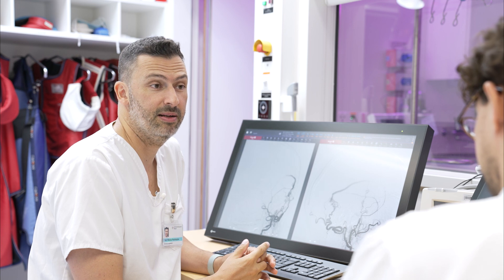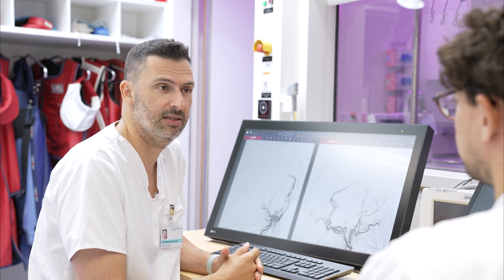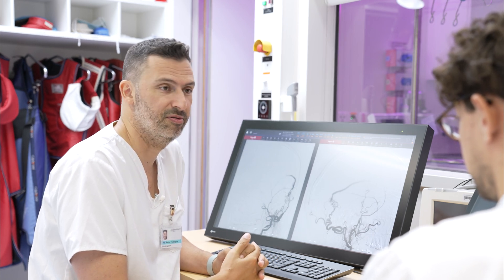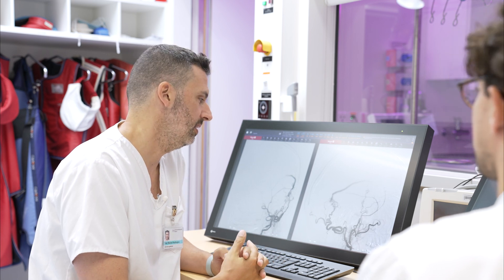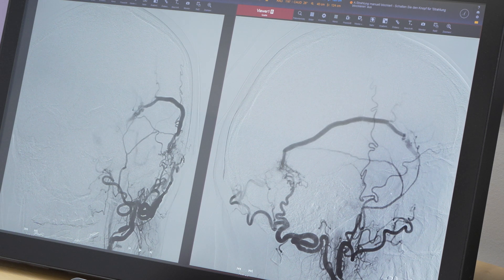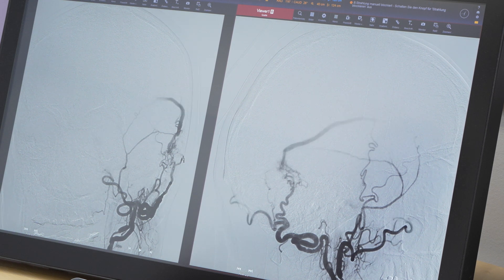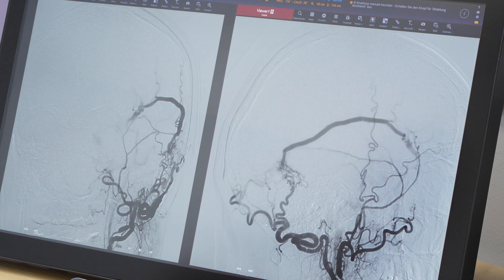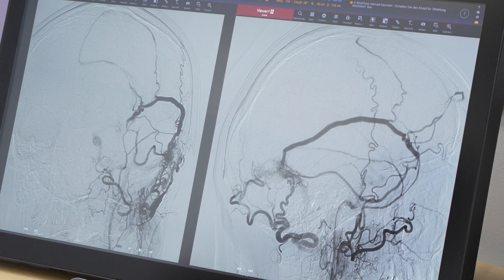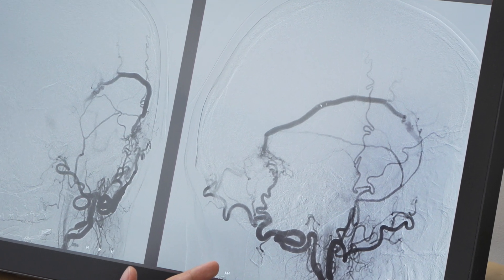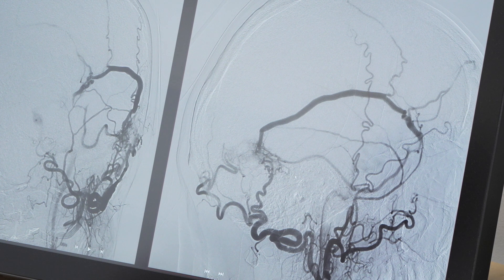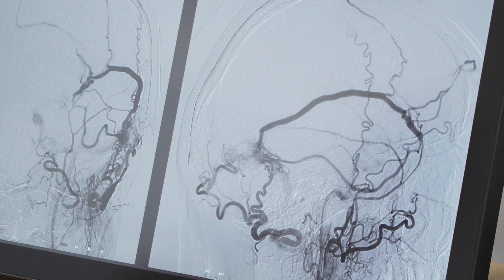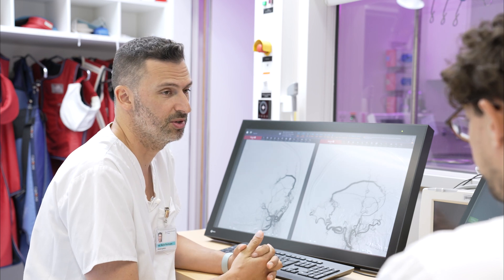It's a very interesting incidental finding — we could have missed this on the initial CTA, but our colleagues found it. We brought the patient to the angio room and did a diagnostic angiography where we could see this really interesting fistula. It arises from vessels of the external carotid artery, from the occipital branches, and also has some feeders from the middle meningeal artery. It's a high-grade fistula and the risk of bleeding is pretty high, so even though the patient is older, we decided to treat sooner rather than later.